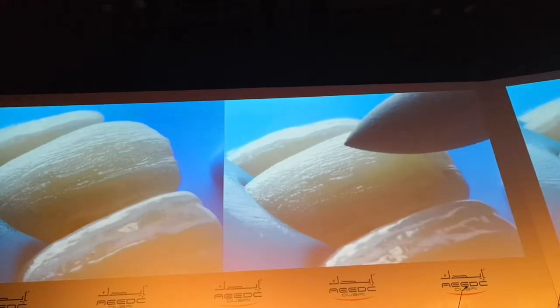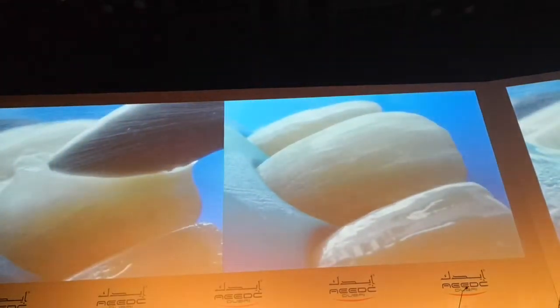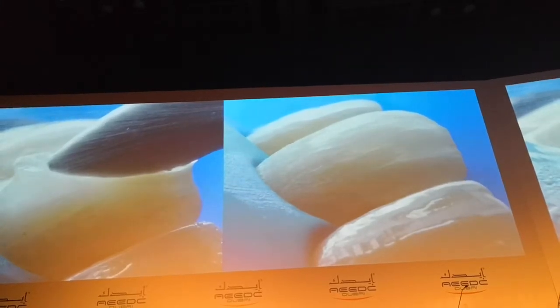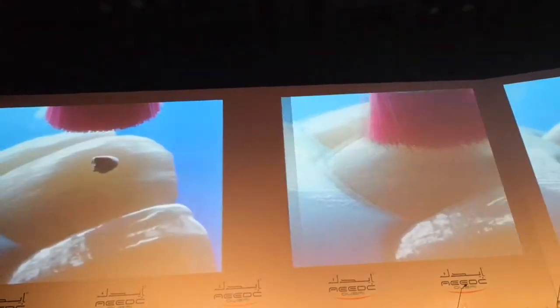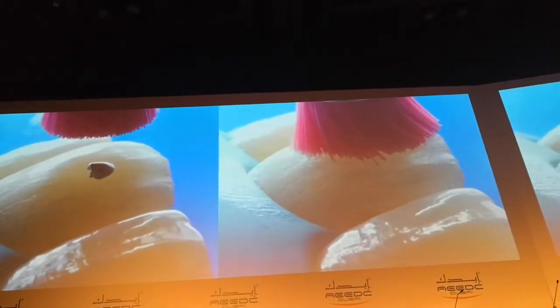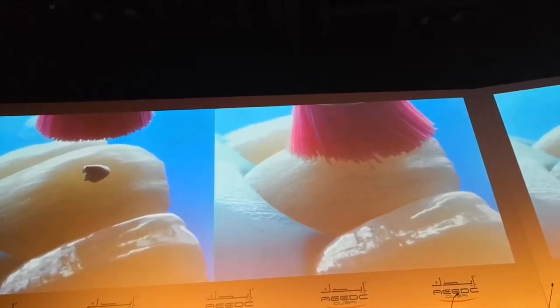After final application I immediately cure. At that time you can check the irregularities after curing with the articulating paper. Then you can remove the scratches with the heavy rubber. And then the surface is ready to be polished. For polishing instruments I use a goat hair brush and felt. If I don't have this, I use a goat hair disc or then the diamond paste. You see the lines created, now it's easy to go for polishing.